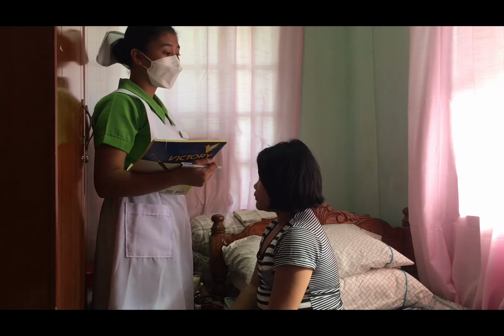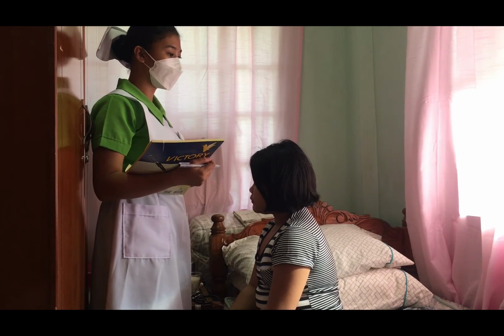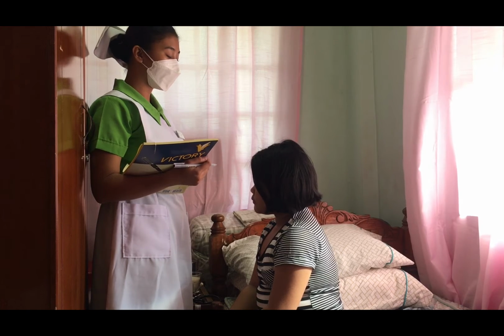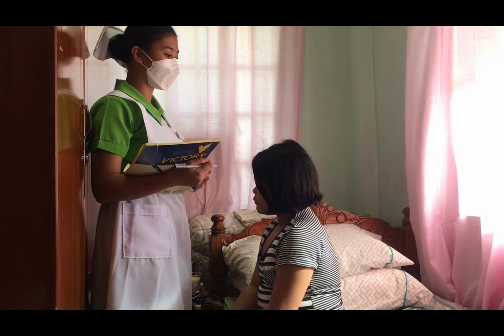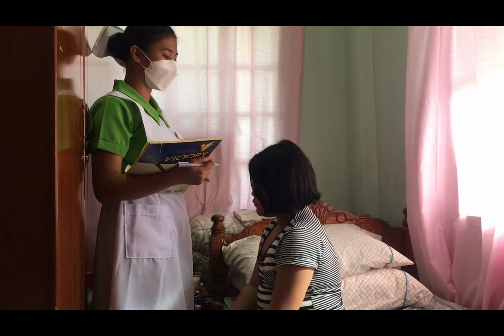Explain the procedure to the patient. So, ma'am, this is a procedure where I am going to insert a tube in your nose. It will provide access to the stomach for diagnostic and therapeutic purposes. It may be a little bit uncomfortable, but a lubricant will alleviate the discomfort. Position the patient in an upright position or high Fowler's for proper neck and stomach alignment.